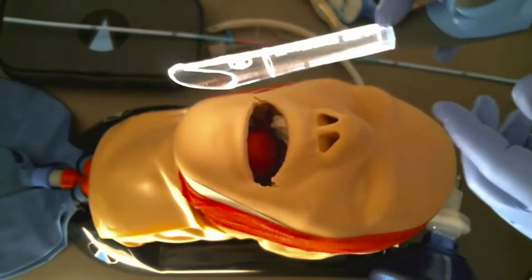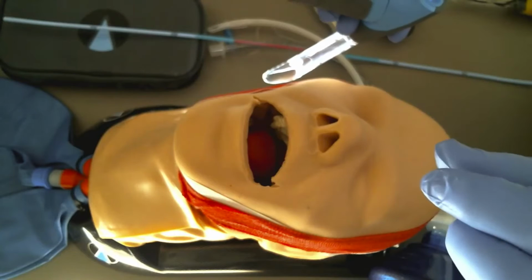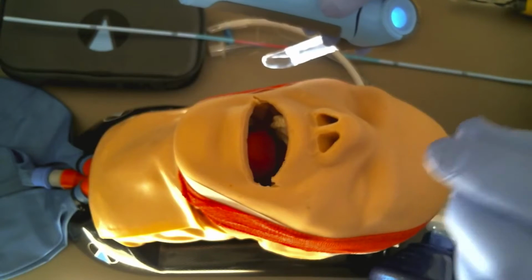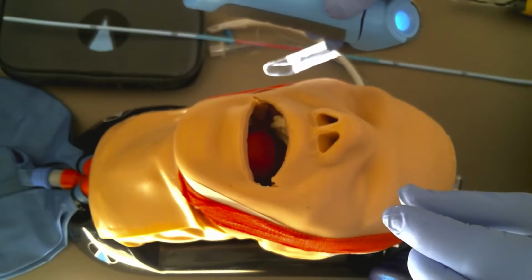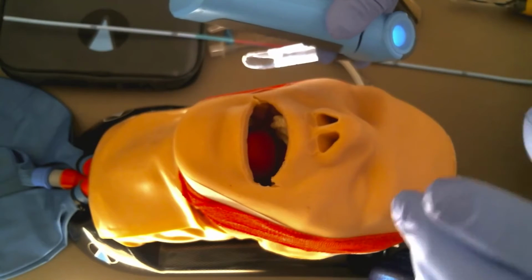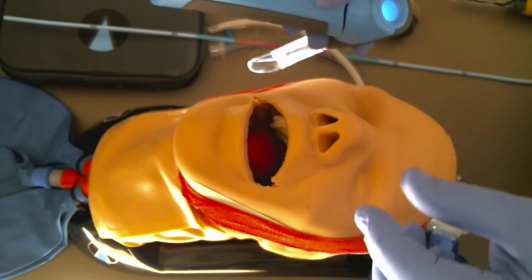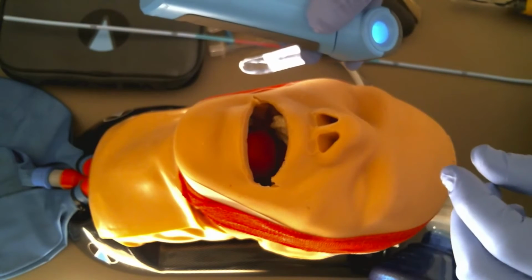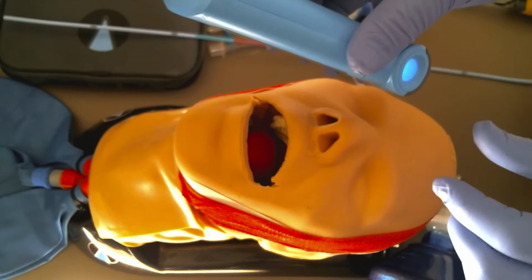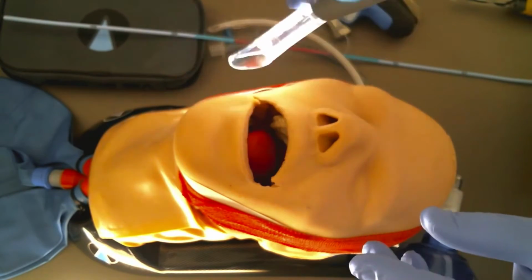So a question that I got today, and I've gotten this a few times, is when I'm starting to intubate with the V-scope, I can't see the vocal cords quickly. And what we've seen in training on cadavers and from observations in the field is sometimes, just like a traditional laryngoscope, people go too deep. So with the V-scope, you're always looking through the barrel. There's nothing blind. This is a direct laryngoscopy.